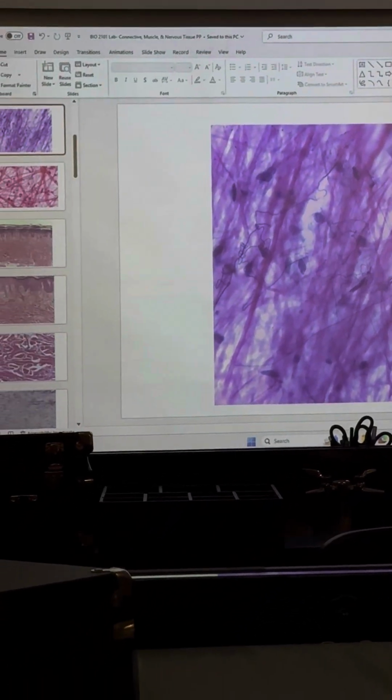Okay, let's see. I think we're almost done, guys. Any of them that you want to review or have any questions on? Oh, this one. What's that one? Blood. Yeah, it's a liquid connective tissue.